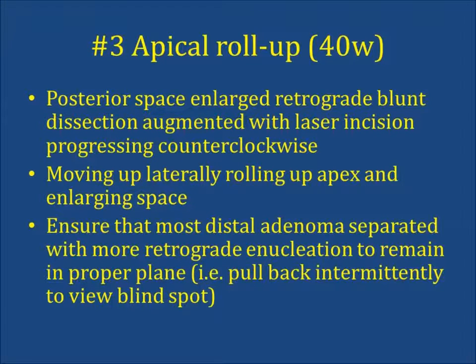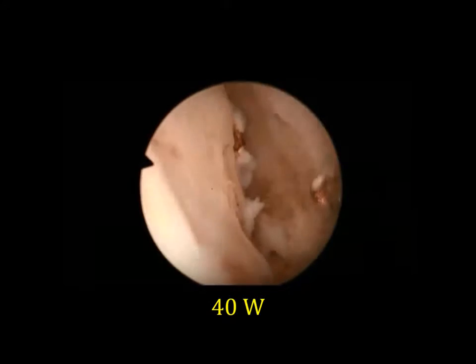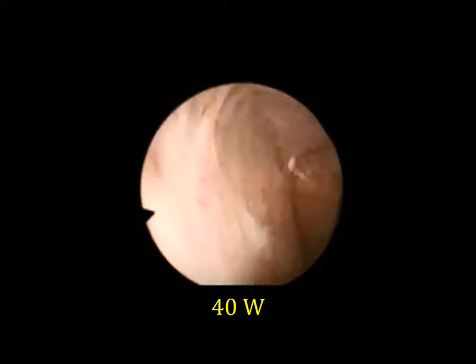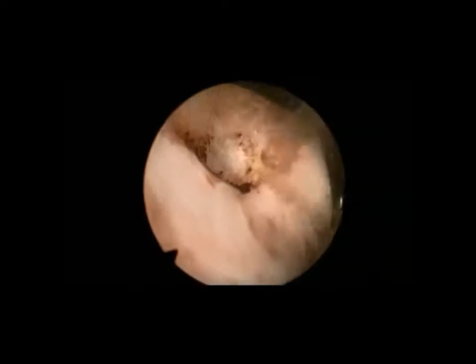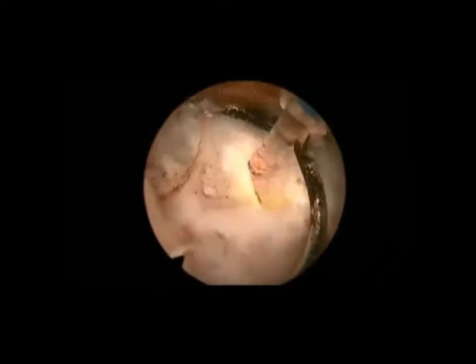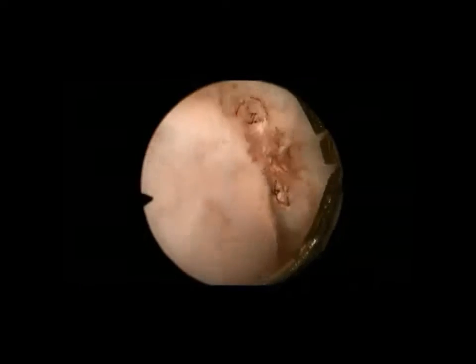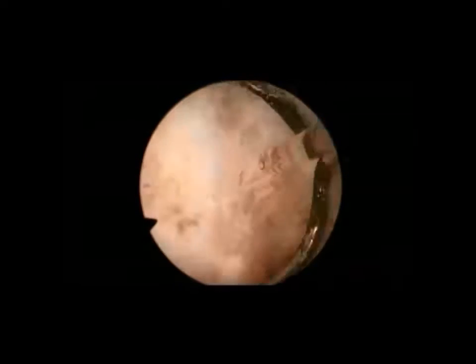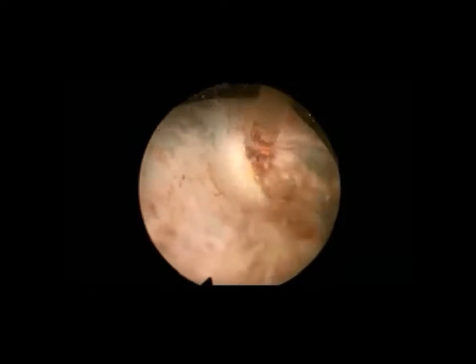In step 3, we expand the posterior space, working retrograde and then upward counterclockwise, laterally and anterolaterally. This is done at 40 watts. One should also remain mindful about the potential for missed apical attachment and should pull back periodically to check and confirm that the distal prostate adenoma has been freed before moving further up in a counterclockwise fashion.